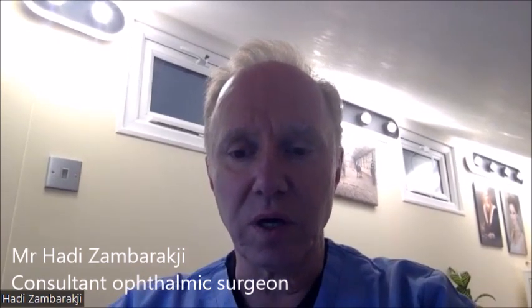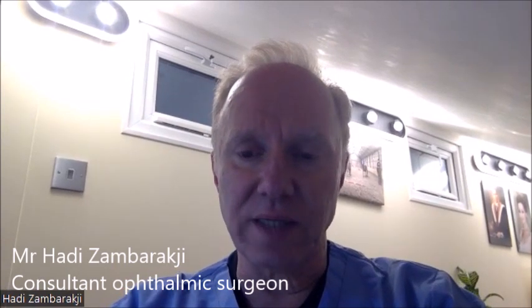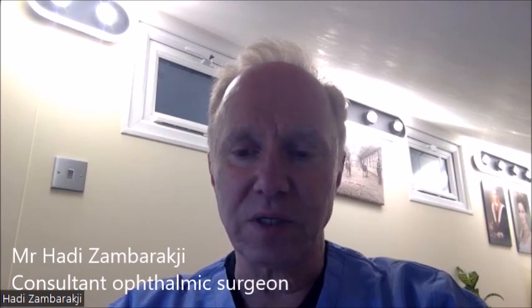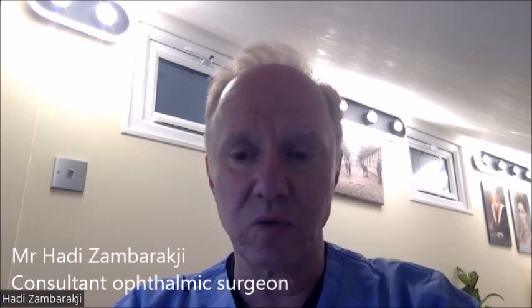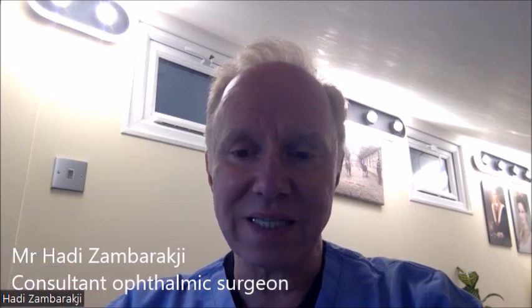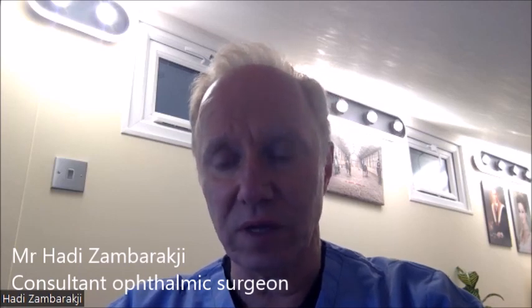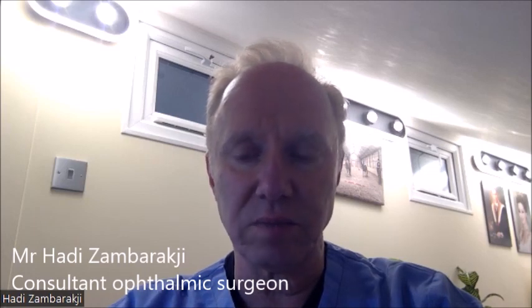And in the middle, there is this other type of lens implant called the enhanced monofocal lens implant, also called monofocal plus or premium monofocal. These are basically monofocal lenses, which also provide vision at intermediate distance as well, but they do not, however, give good near visual acuity unless you aim to make the patient slightly myopic. And the point of this last lens I'm mentioning, the enhanced monofocal or monofocal plus, is that it's not a multifocal lens, and therefore would not carry the side effect profile that we know exists with multifocal lenses. And we will, in a minute, be touching on the side effect profile of multifocal lenses.